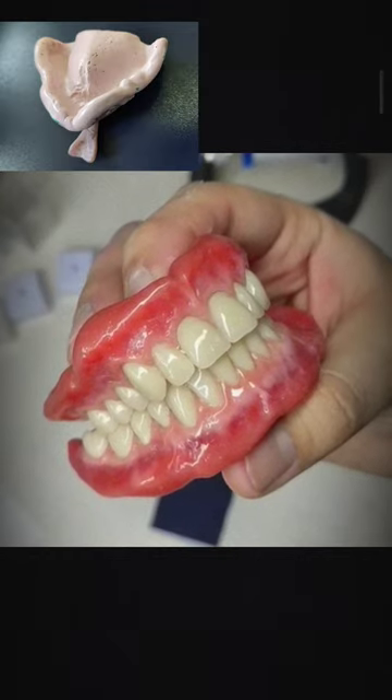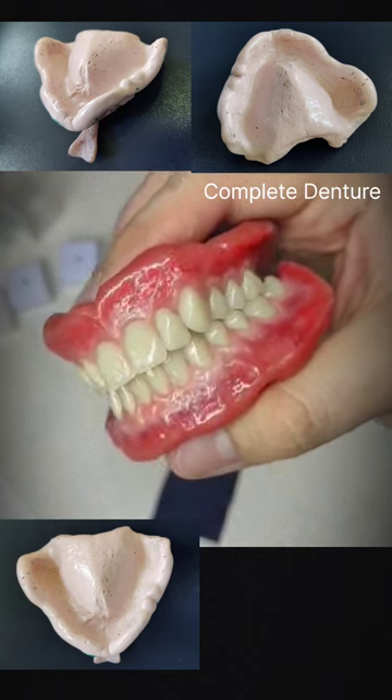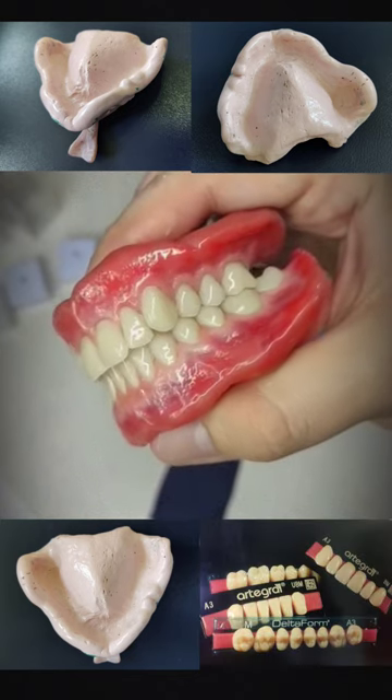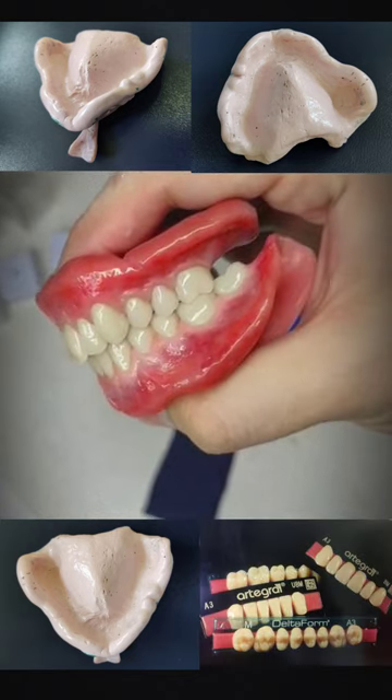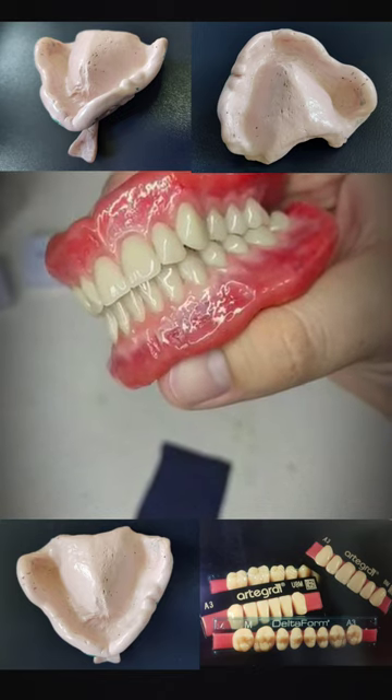A complete denture is a removable acrylic replacement for teeth, soft tissue, and bone lost in an entire dental arch. Complete dentures consist of two main parts, namely the artificial teeth and the denture base.